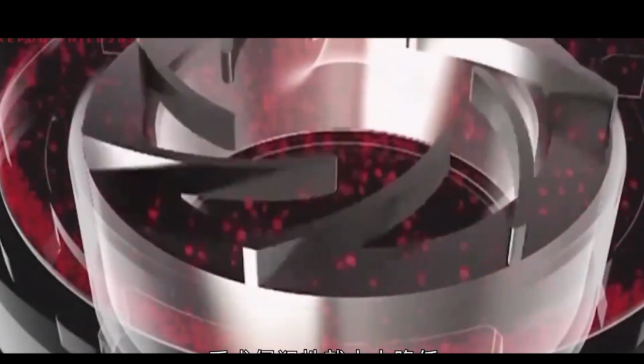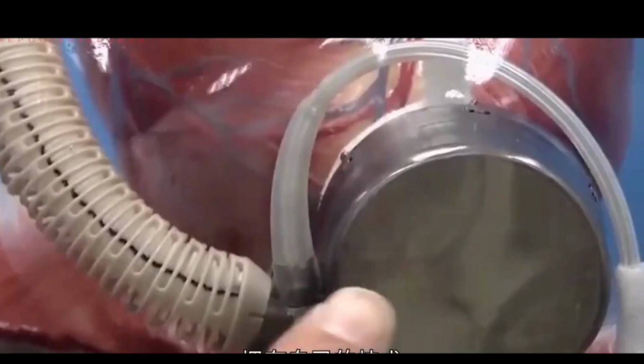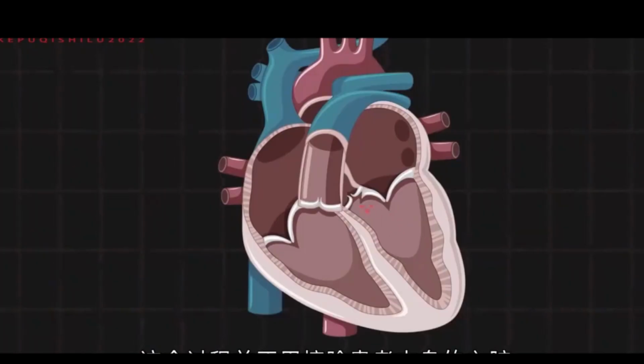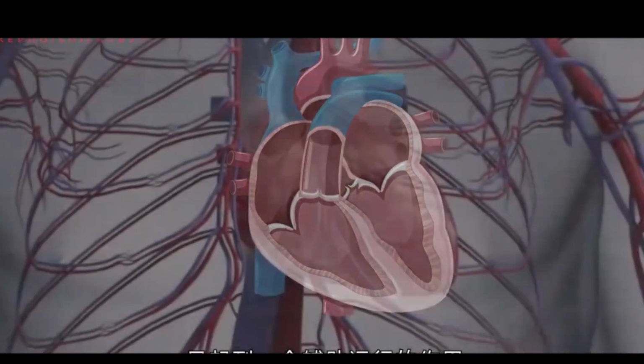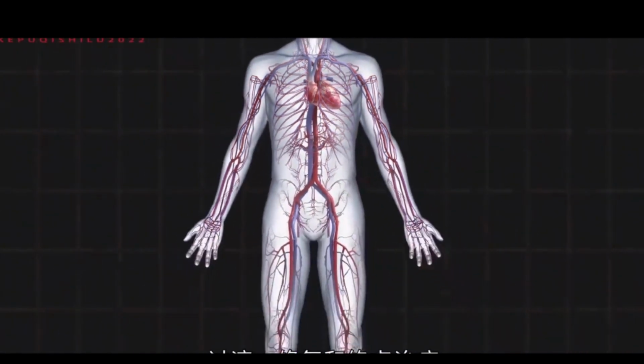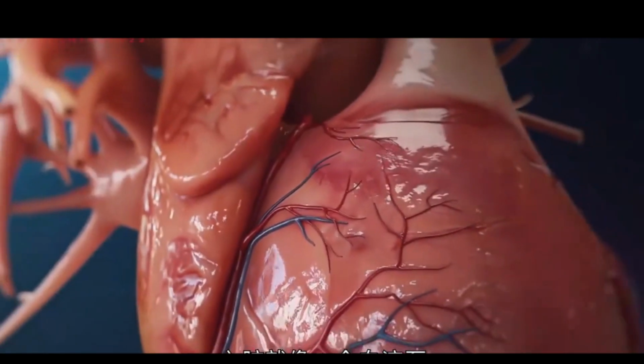Under technological innovation, artificial hearts have begun to replace native organs and perform tasks in the human body. Some people speculate, is there any hope of eternal human life? In fact, whoever wears an artificial heart needs to endure a life of not being able to soak in water, not being able to fly, and constantly listening to mechanical noise. However, the opportunity to survive created by artificial hearts is the greatest value at this stage.